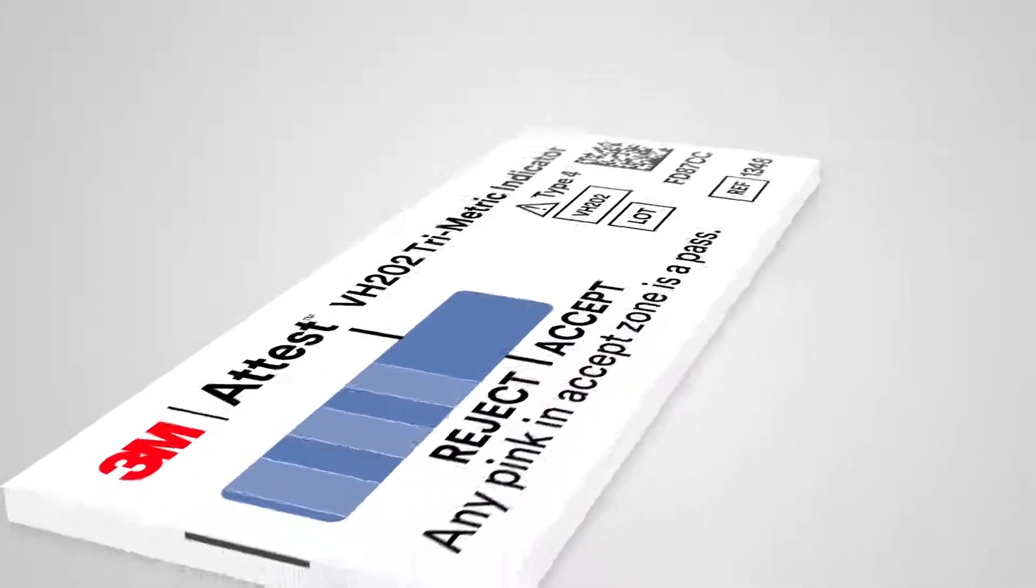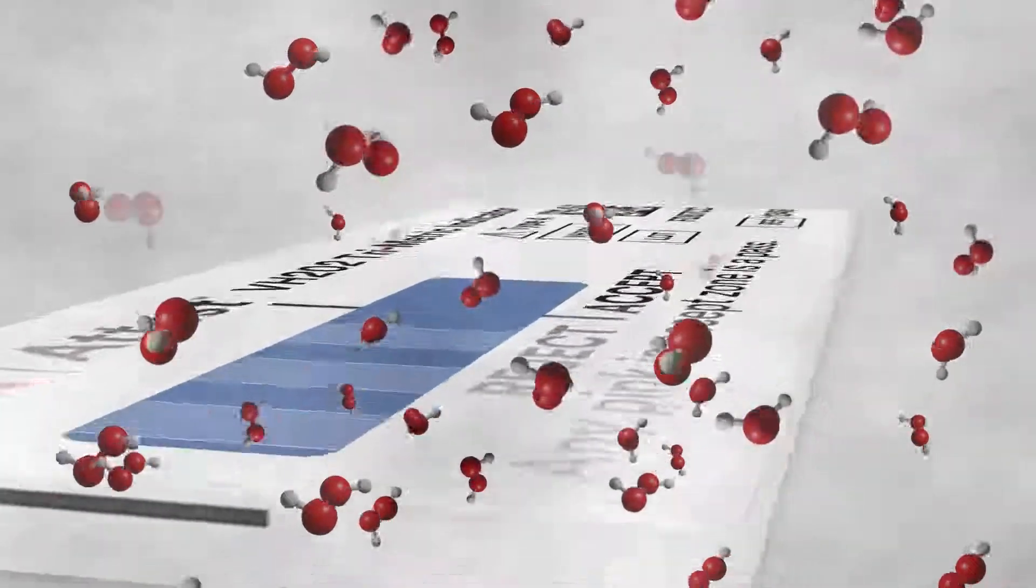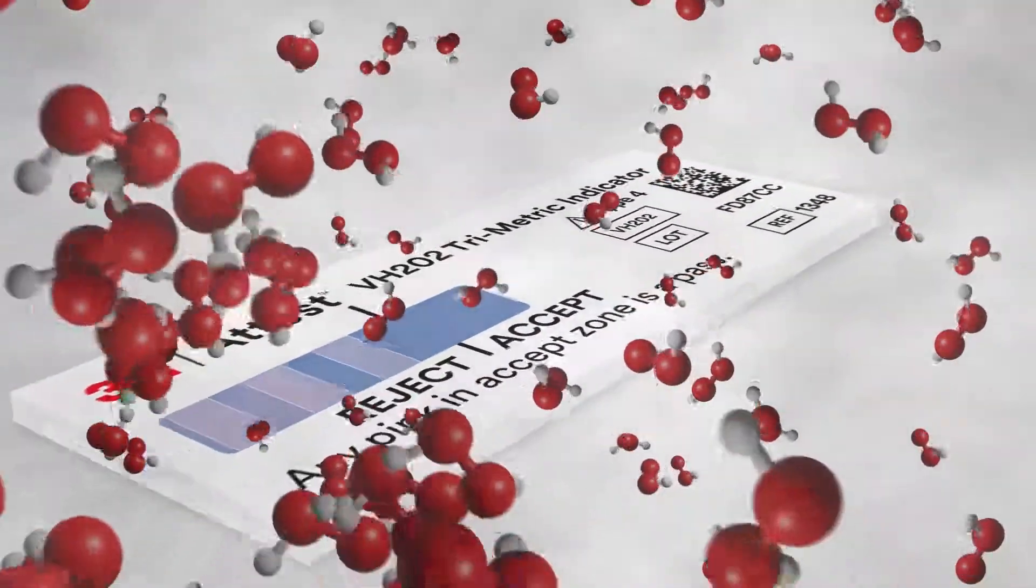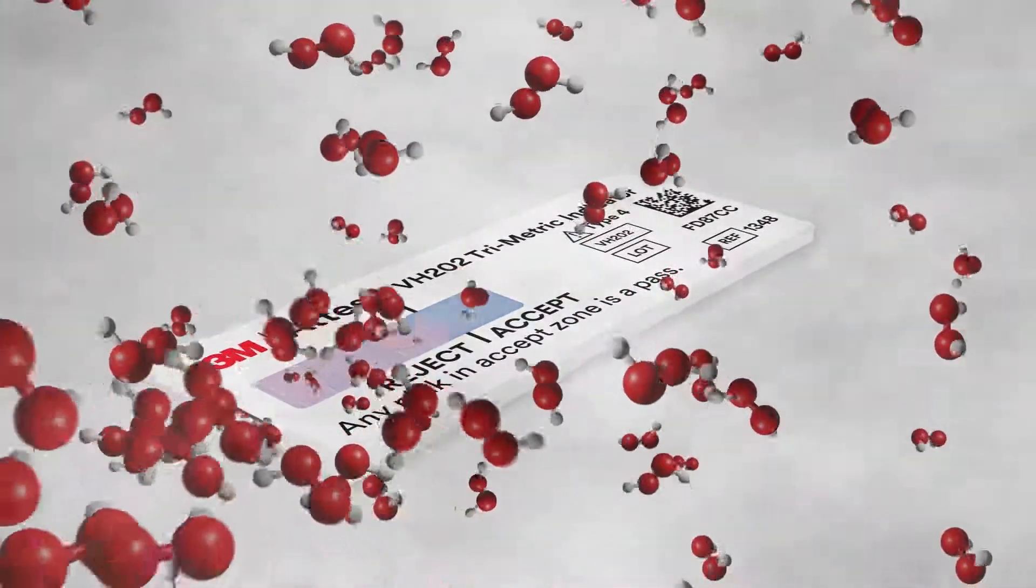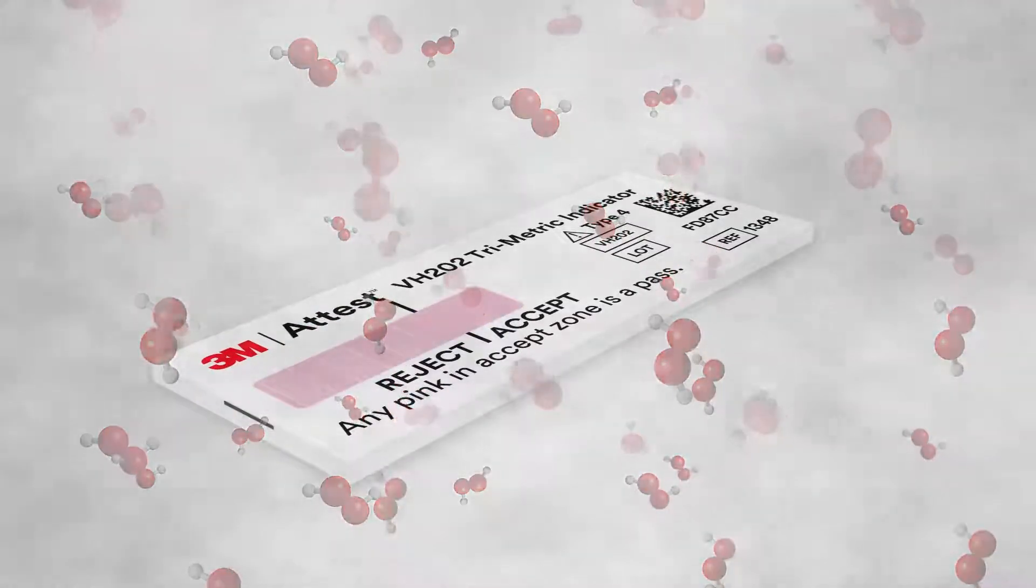The unique state-of-the-art construction of the 3M Attest Trimetric CI features a designed pathway through which the VH202 sterilant must penetrate and travel to change the reactive chemistry from blue toward pink, providing a moving front technology in a hydrogen peroxide chemical indicator.